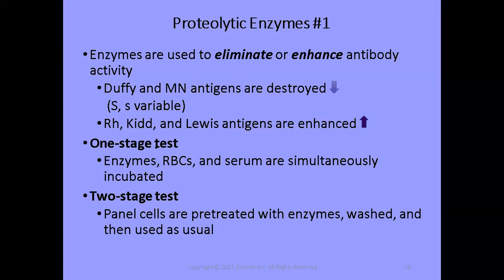So when they're doing enzyme treatment, there's a one-stage test where enzymes, red cells, and serum are simultaneously incubated together. Or there is a two-stage test where panel cells are pre-treated with enzymes, washed, and then used as they normally would be used.